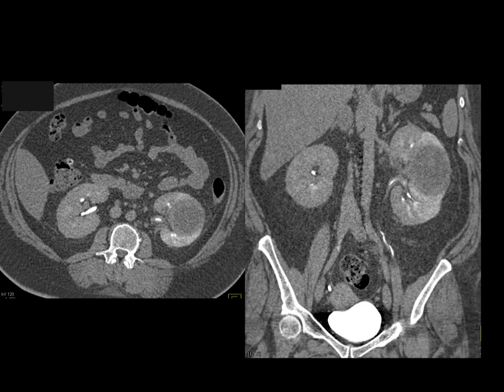Many people will say that you don't need CT for infection, and you get CT when patients don't respond to the patient's therapy. Okay? And one of the reasons you do that is because sometimes people will have issues that persist, like, for example, if you have some sort of fistula or something to that effect, it can be somewhat challenging. So again, it's important to really think about the possibilities.